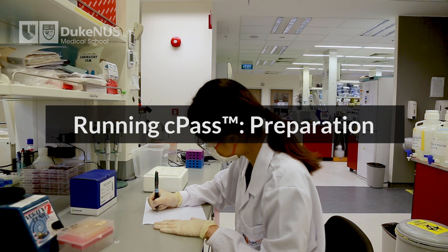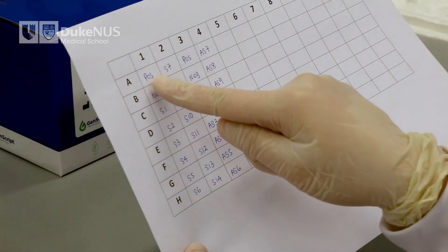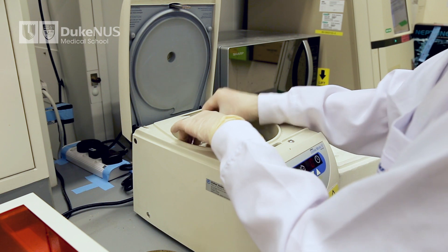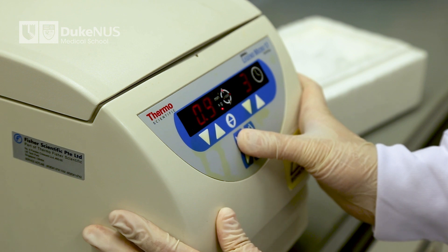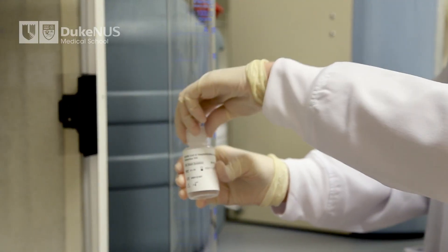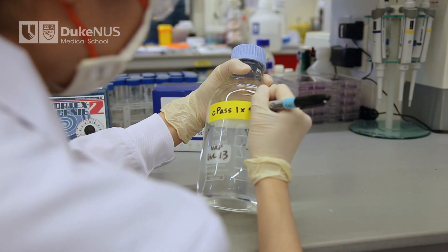Before you start any experiment, you need to know how many wells or reactions you will be running. Each kit can accommodate 92 reactions at most; the remaining 4 wells are used for two positive controls and two negative controls, which are required for each experiment. We recommend spinning down the positive, negative, and sample tubes at the start. First, prepare the one-time concentrated wash buffer by diluting the whole bottle of 20x concentrated wash buffer to a total of 800 milliliters with deionized or distilled water. Store the 1x concentrated wash buffer at 2 to 8 degrees Celsius when not in use.